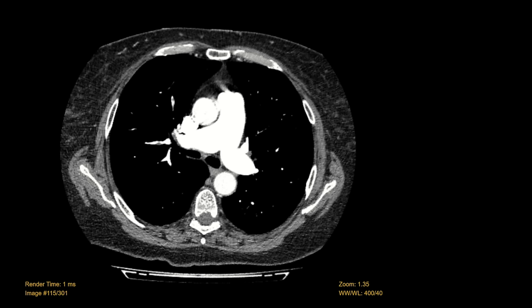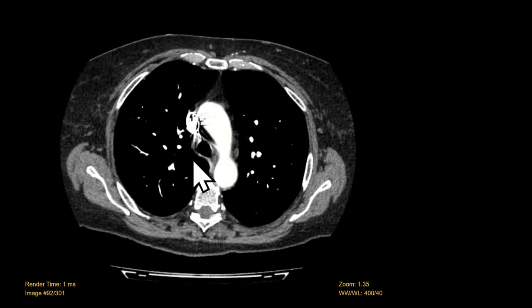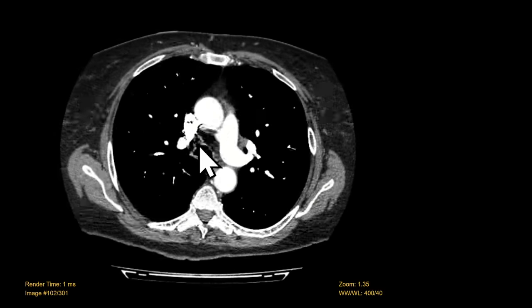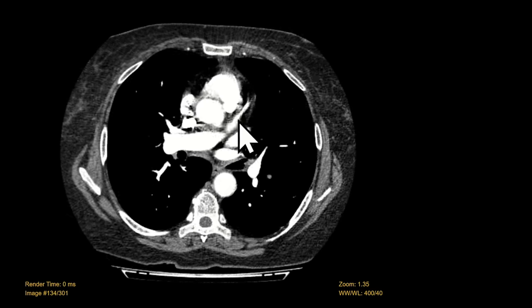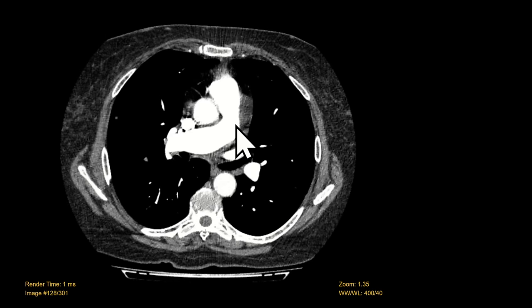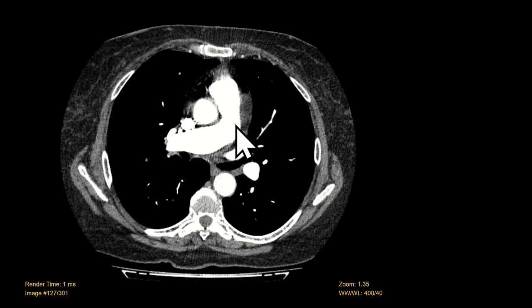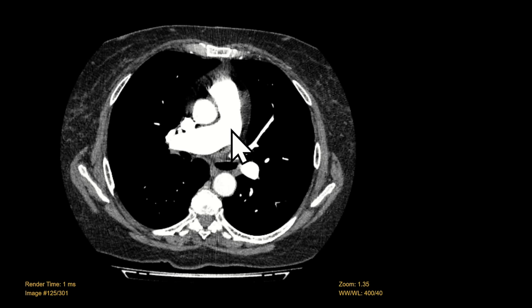For a CTPA we image very shortly after injection of IV contrast — about 15 seconds or so. Contrast goes from the veins into the right heart and then into the main pulmonary artery, and then we image. We want a lot of contrast in the pulmonary arteries so we can see any pulmonary emboli as relatively dark filling defects on a bright background.